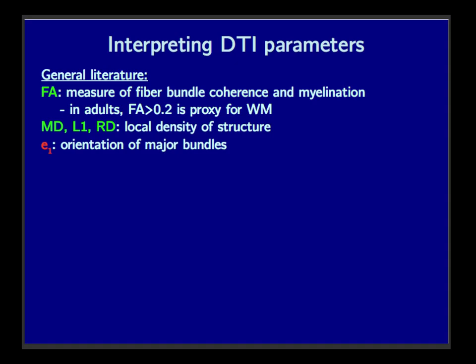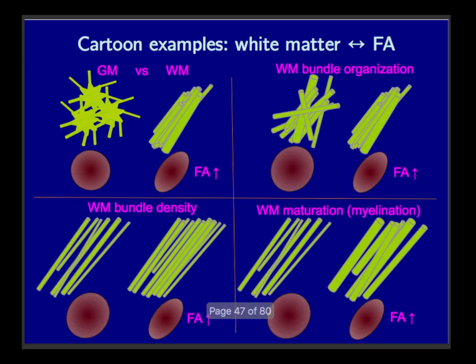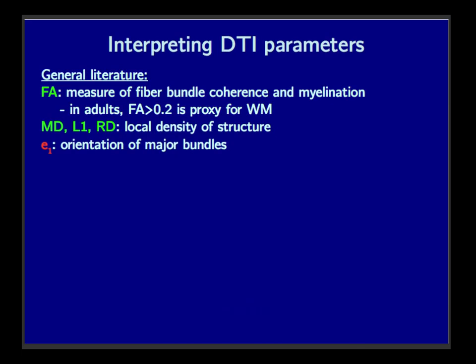And if you notice too, we get for free in any case, not just is there structure, but if we see structure, the shape of it always tells us how that structure is running, right? This ellipsoid isn't drawn like this because it's going to tell me just A, there is structure, and B, how is it oriented in space. And that's what the eigenvectors tell me. Okay, so these are the basic properties that we tend to look at and try to quantify with these.